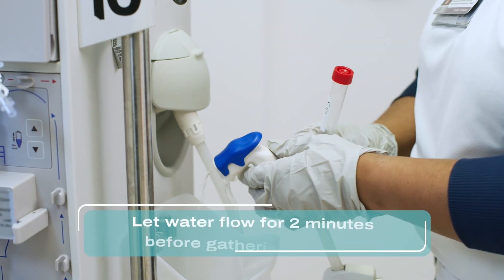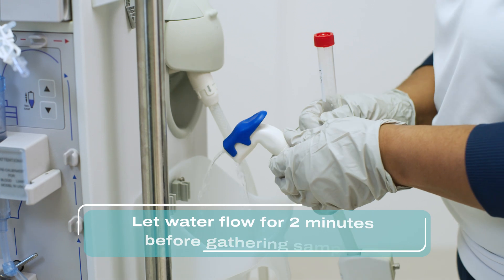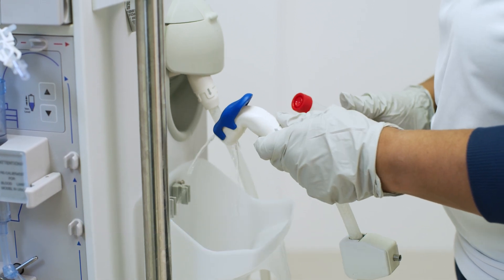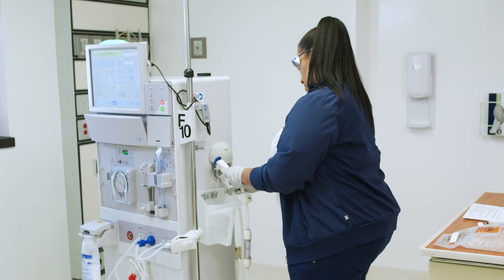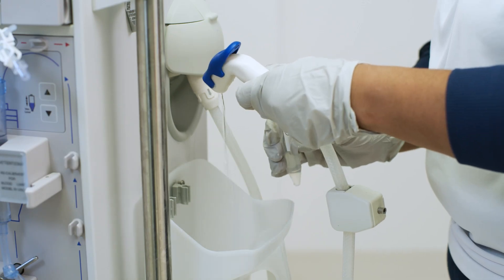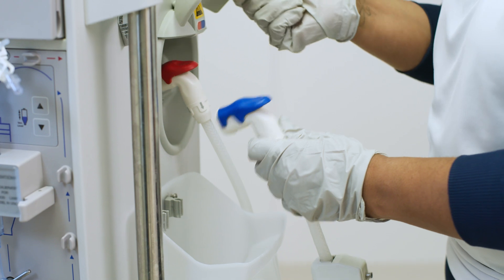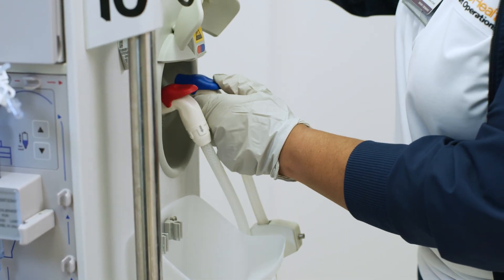Turn on the water and let it flow for two minutes. Then, using the clean catch method, fill the tube with water. When the tube is full, replace the cap and turn off the flow of water. Reattach the line and turn off the machine.